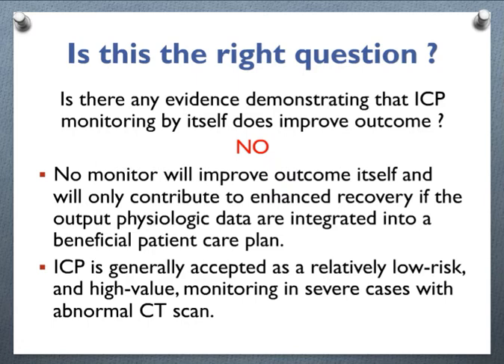I usually tell a story. There is an old colleague of mine, a university neurosurgeon, who said, I was able to monitor ICP in the 70s, and I asked him, how did you do it? I put a catheter, I went home, I returned to the hospital the day after, I looked at the tracing and saw a lot of curves, B waves and so on, but you were not treating the patient. You are measuring a parameter, but you are not doing anything with it. We are doing it now, because from the monitoring system information, we are trying to change our treatment. And we can say that ICP is a low-risk, high-value monitor today.